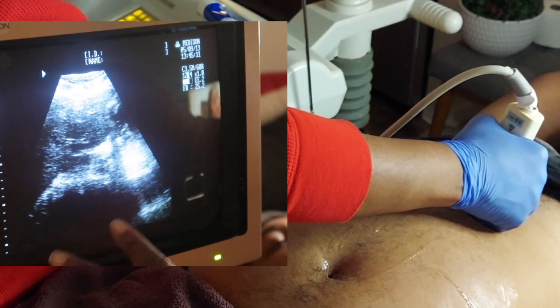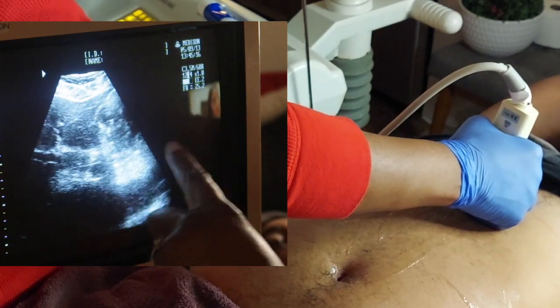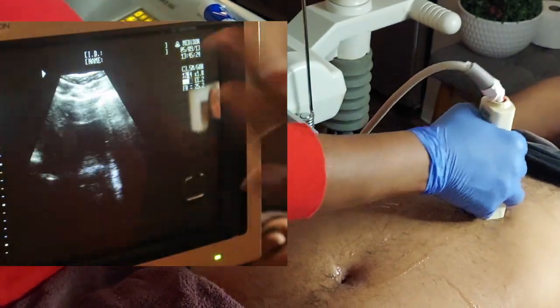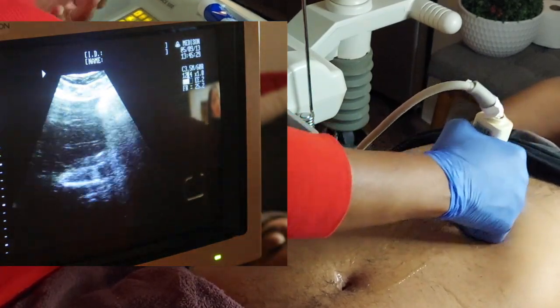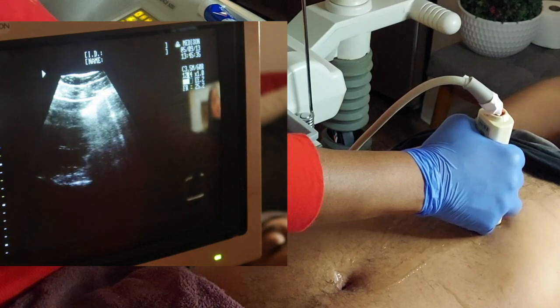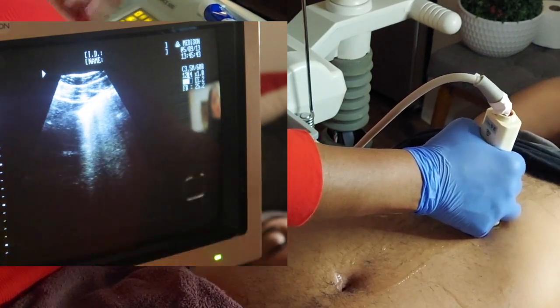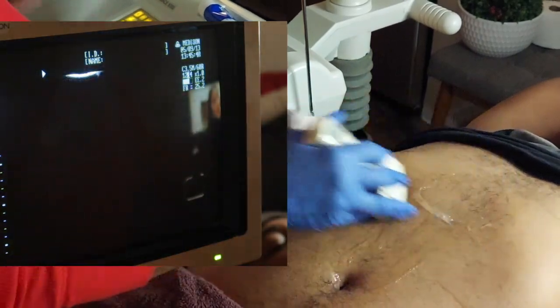In a real world, if that was all I could get, I would freeze that and write across my screen 'pancreas area,' so the doctor knows that I'm in that vicinity of the pancreas and I'm not seeing anything major pop out at me. On my report, I will say gassed pancreas, or limited due to body habitus. The patient ate, so due to patient eating, pancreas is gassed. So moving on.